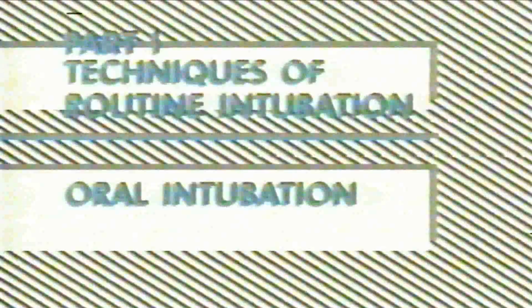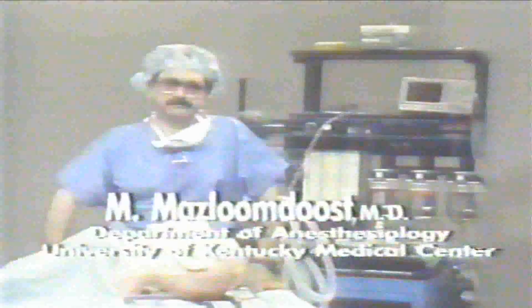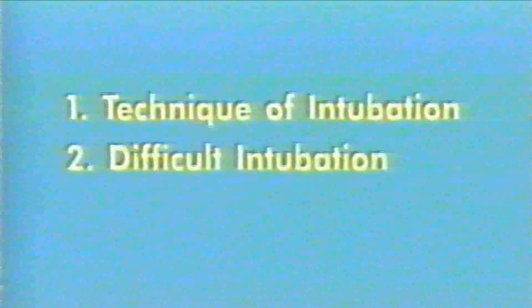Aimed mostly to achieve this goal and solving problems of difficult intubation and prevent failed intubation. To achieve this goal, it would be necessary to demonstrate stages of correct intubation technique step by step, since incorrect techniques are major and frequent causes of difficulty. So this demonstration is divided into number 1, technique of intubation, number 2, difficult intubation.